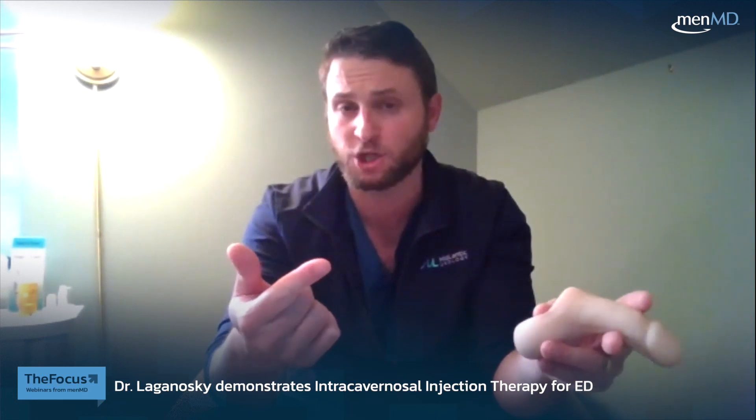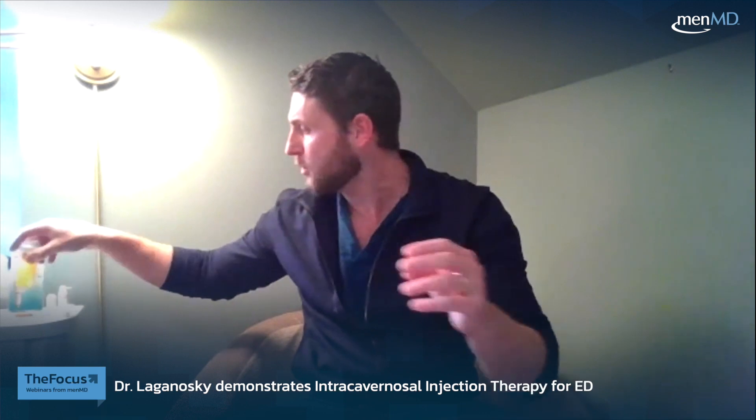So here I have a penis model — this is what we're going to use when we do the injection therapy. I'll show you the appropriate technique in terms of how to draw up the medication first, and then we'll do a couple of sample injections to show you do's and don'ts. When you get your Men MD kit or your injection Trimix or Biomix therapy kit, you'll notice the medication basically comes in a medication vial like this.